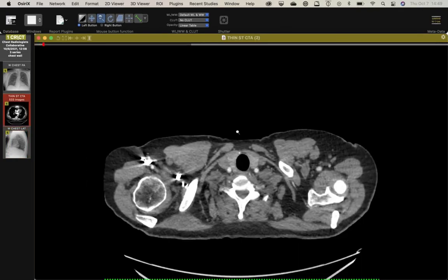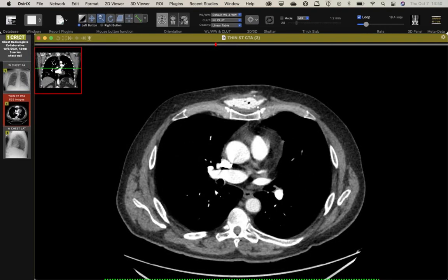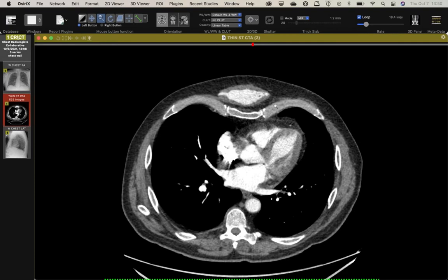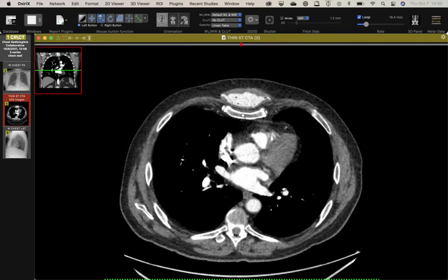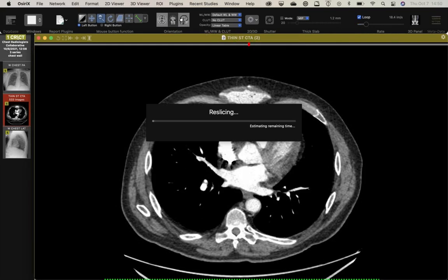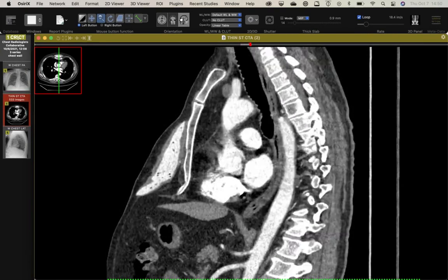So he had a CT looking for PE. And what's interesting is he has this funny looking high attenuation blob. It looks very well circumscribed. It looks artificial, located in the subcutaneous tissues. You see it even conforms to his pectus deformity. So it turns out in his record, he had this repair done way back in the 1970s.